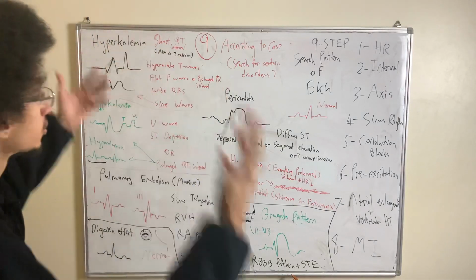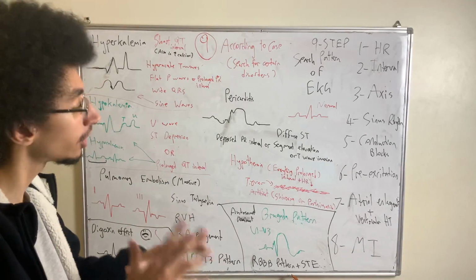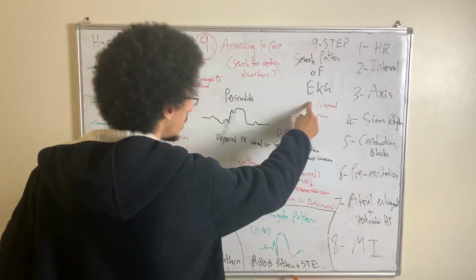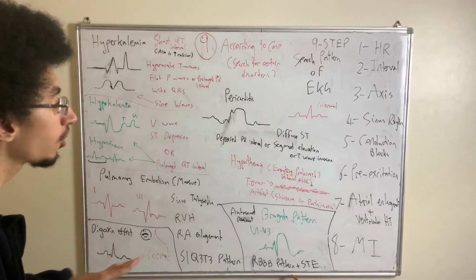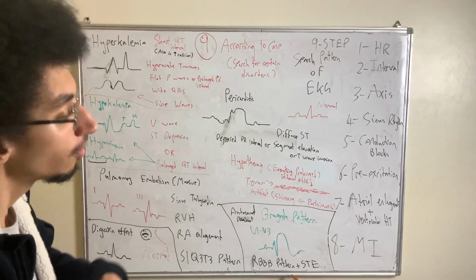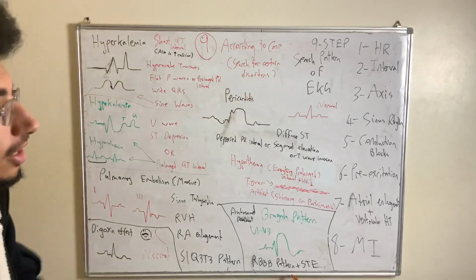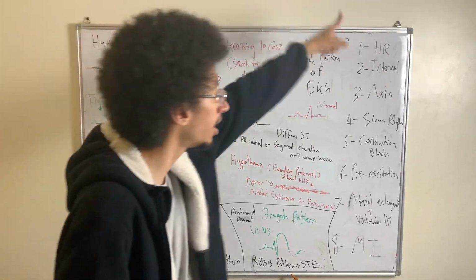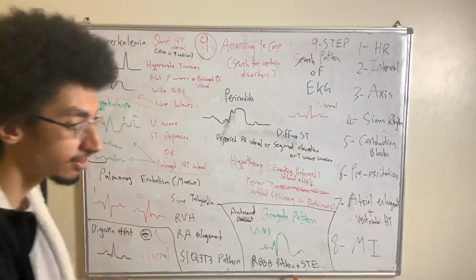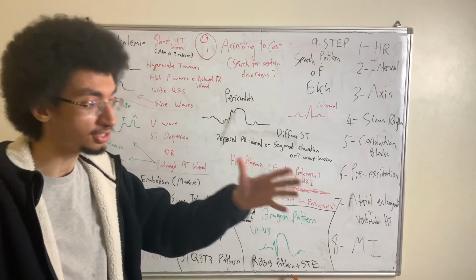And now we have finished the disorders, and now we have finished searching for step number 9. The normal EKG tracing, like in lead II, like we said, PQRST. Intervals are normal, axis is normal, none of these should be present. But with history and exam, you will do your 9-step pattern when searching on the EKG, starting from the heart, all the way to step number 9, according to the case. Now we have finally finished our EKG series.